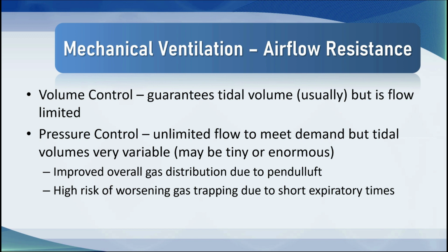Now, pressure control, there is unlimited flow to meet demand, but the tidal volumes can be tremendously variable. They can be tiny, they can be enormous, and sometimes they go from tiny to enormous in half a dozen breaths. But if you increase the inspiratory time, you get overall tremendous gas distribution due to the Pendelluft effect, but there's a high risk of worsening gas trapping due to short expiratory times.